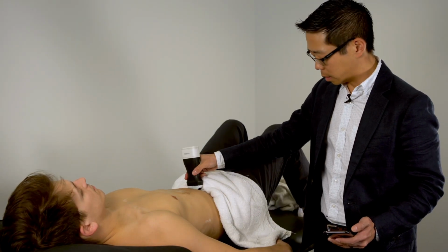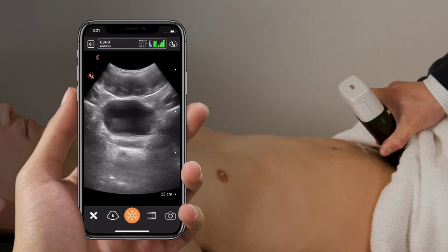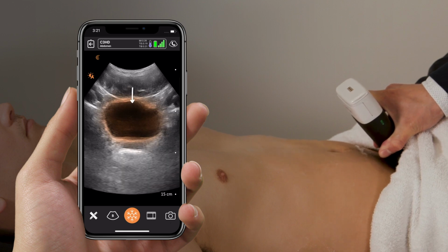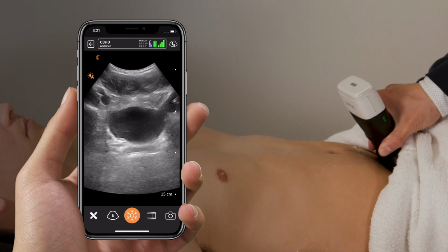The next place to look is the pelvis. So we'll orient our probe in a transverse manner initially. And our landmark here is the bladder, so it's a cystic fluid-filled structure. So we're going to sweep through this area to see if there is fluid outside of the bladder.